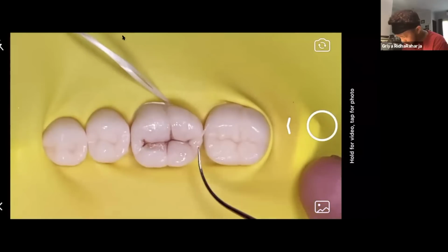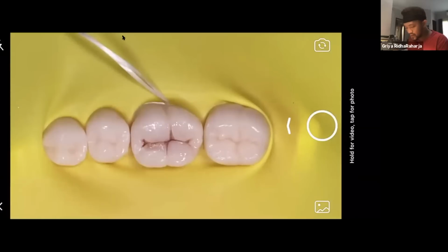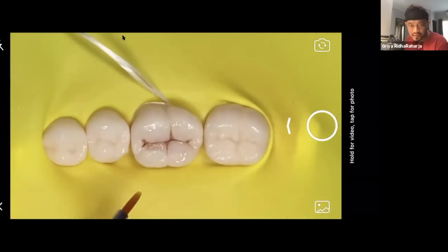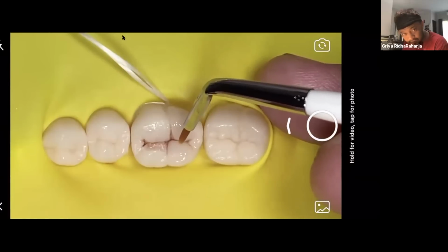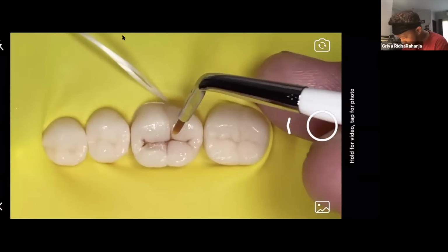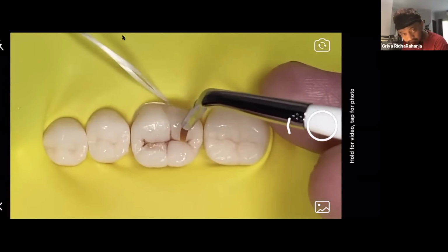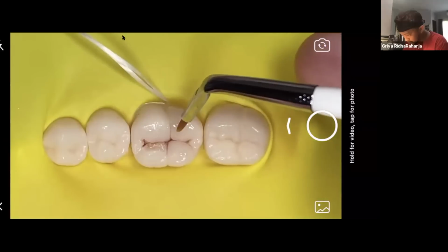Okay, and then remove the excess. Okay, so now using your brush, because in the central it's so big, the gaps, you can push back into the left like this with your brush. Okay, easily, gently. Okay, push back again, back. So now they have a good line.